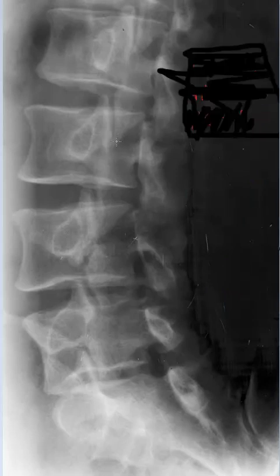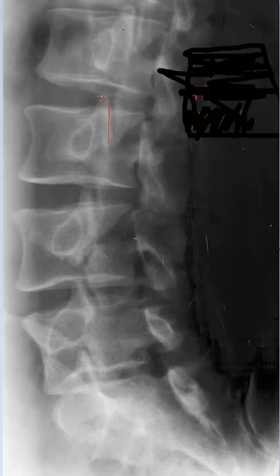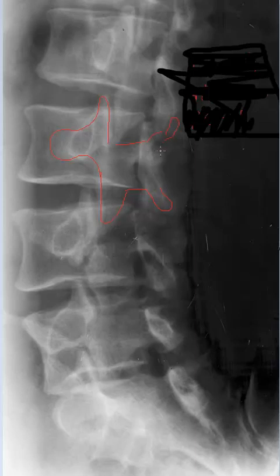When we do lumbar obliques, a certain structure is created and the orientation of these structures gives us the visualization of a dog — we call this dog Scotty. We really only see the front half of Scotty, maybe with a back leg and a tail. Scotty has very big eyes, and this Scotty represents one half of the posterior arch.